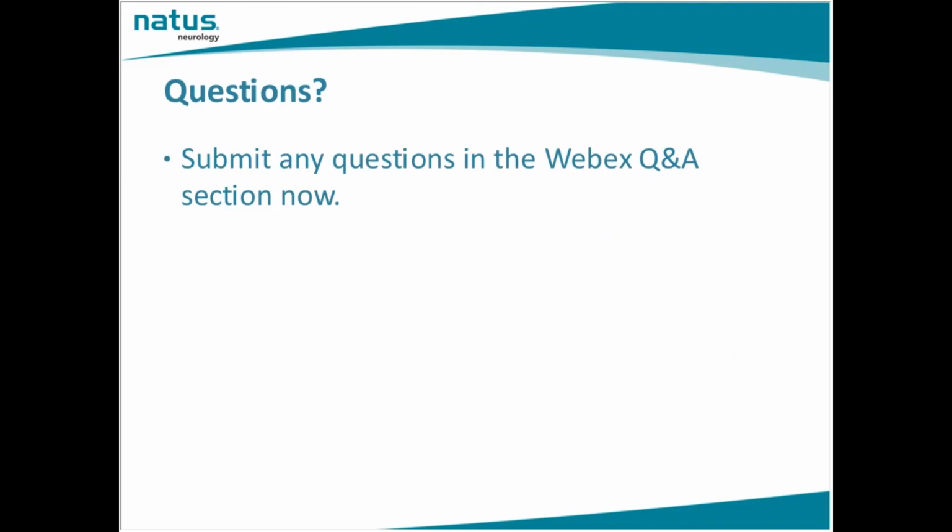Okay, Ann, here's the first question. It says, what exactly are you wanting to document when you say that you need to obtain an accurate history prior to the exam?